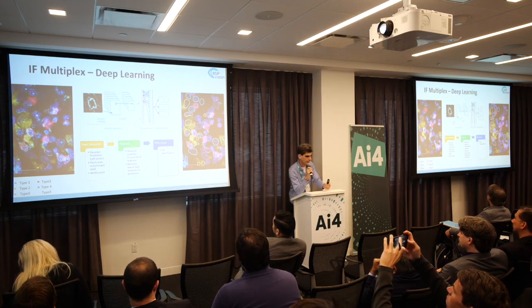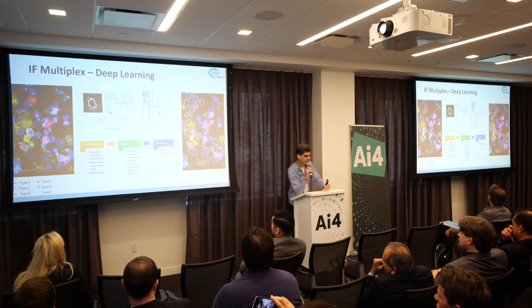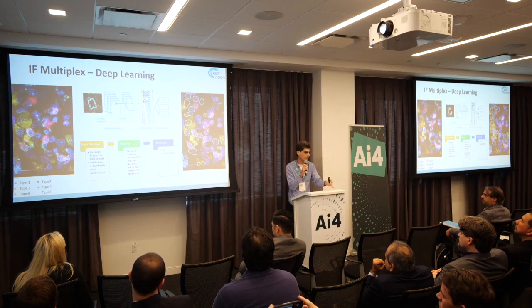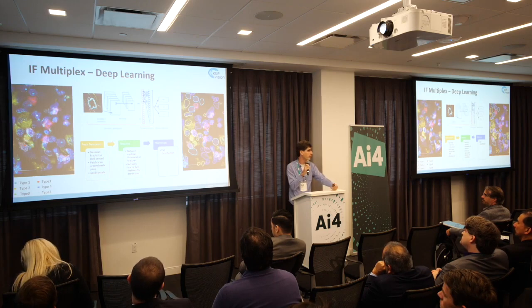So once you see where your network is failing, it's very important to understand these cases. It's not just a black box, because once you understand these cases, in your next training session, you can show the network more examples of the difficult cases. You can try to artificially create more examples of the things that the network is having trouble with.